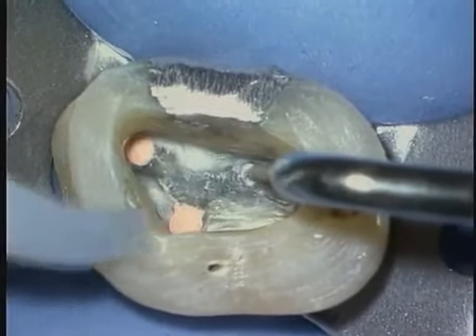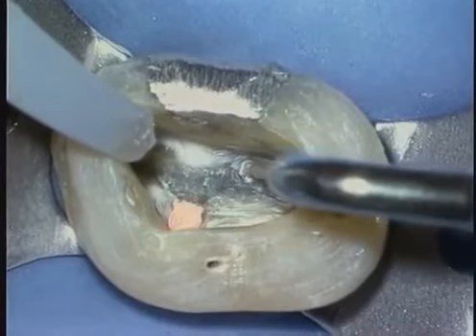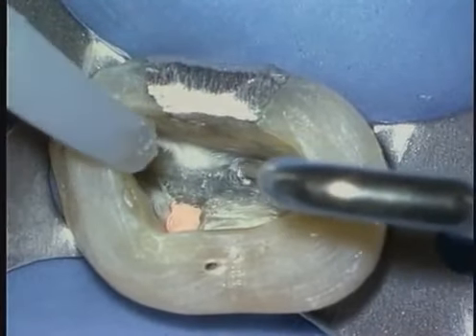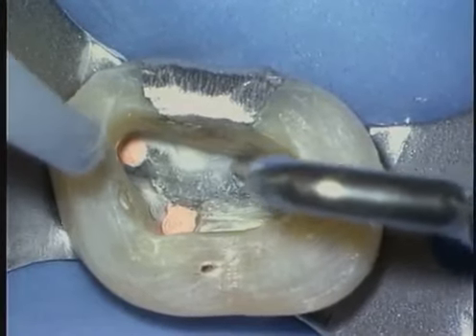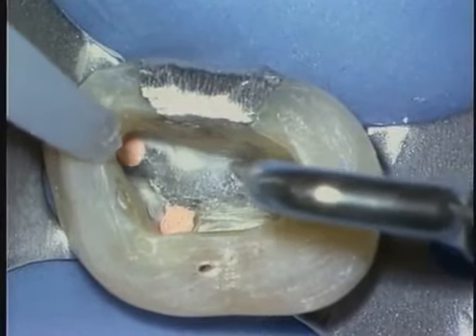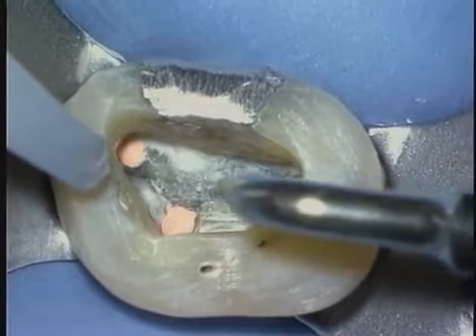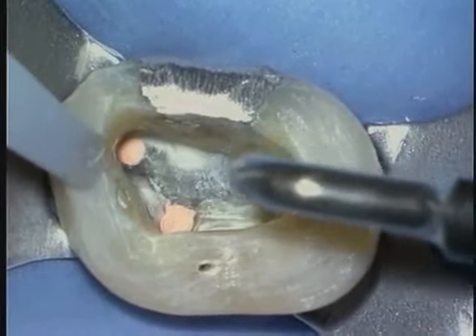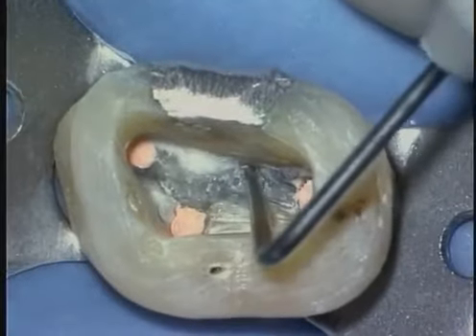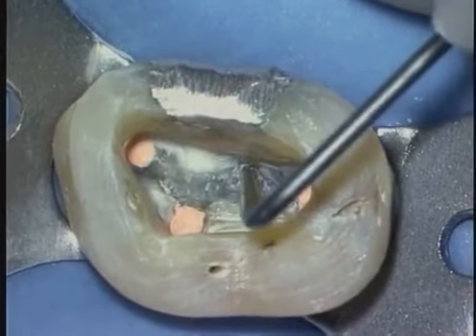A very small, progressively less tapered instrument like an Endo 4 can be used. Notice its small profile gives us incredible control and vision when minutely and discreetly brush cutting away material. Air blows out the debris and gives the operator continuous vision.